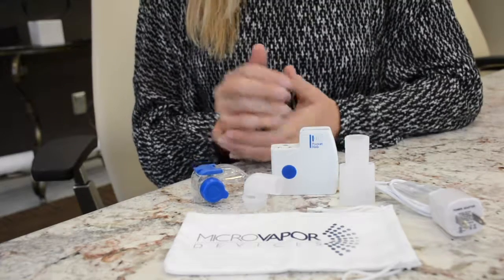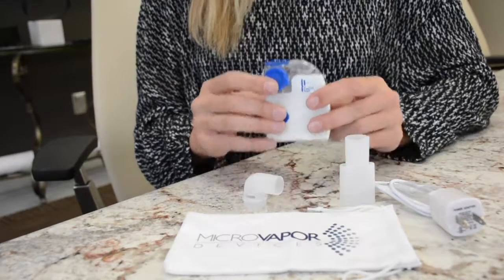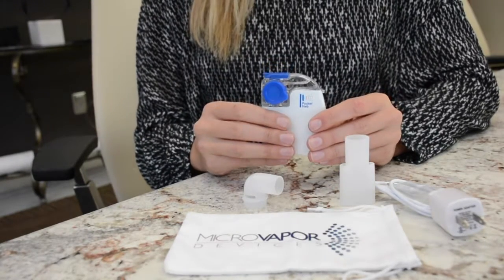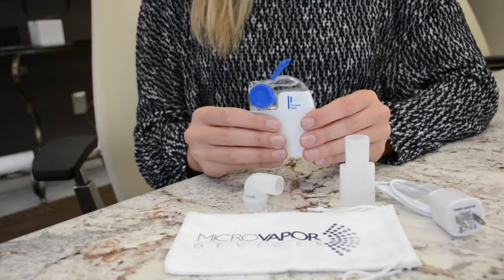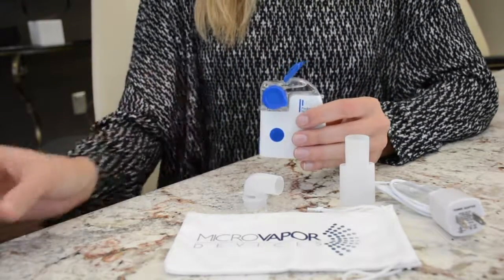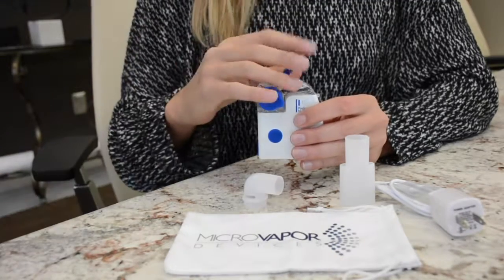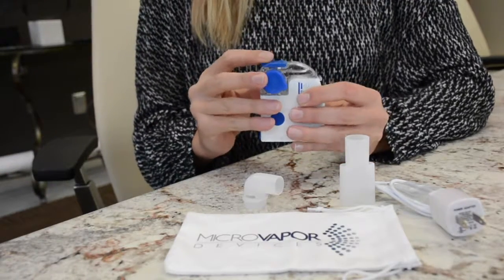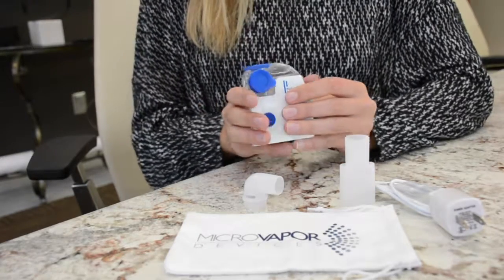First I take the medication cup and slide it onto the control unit until it clicks into place. Once you have the medication cup on the unit, you open the blue cap on the top of the medication cup and put in the distilled water if you're cleaning the cup, or put the medication in if you're taking a treatment. Then you connect the mouthpiece, or if you're using a mask you can connect the mask adapter. I typically use the mouthpiece when I take my treatment.